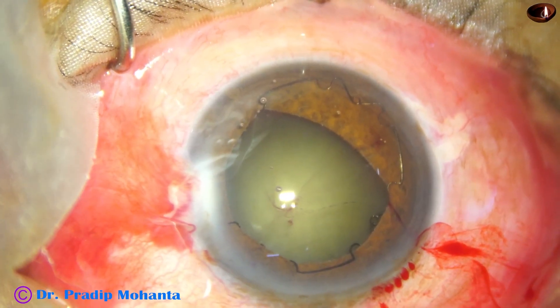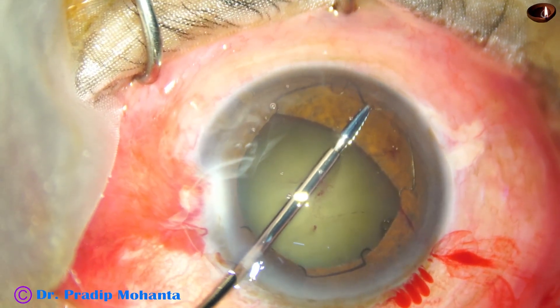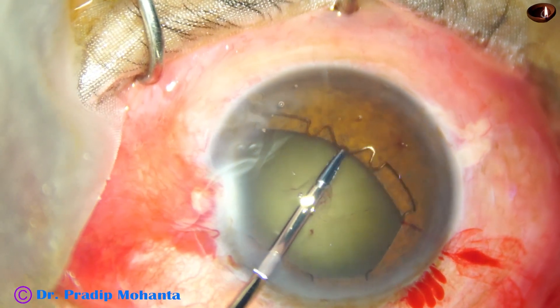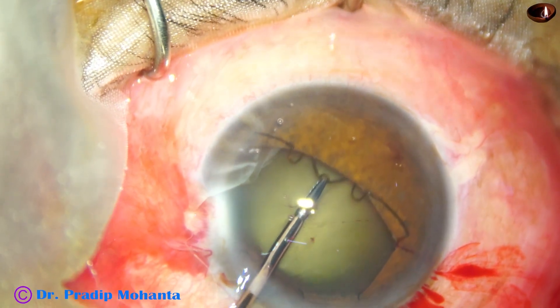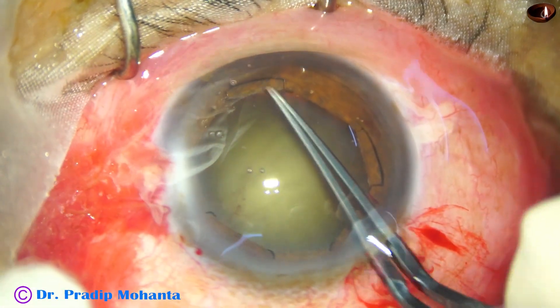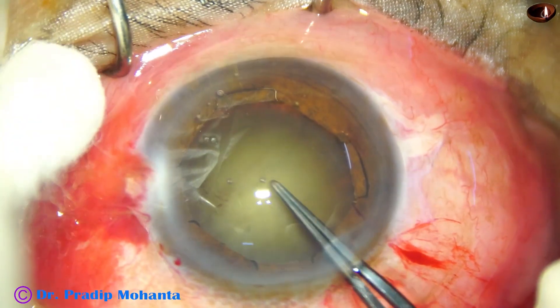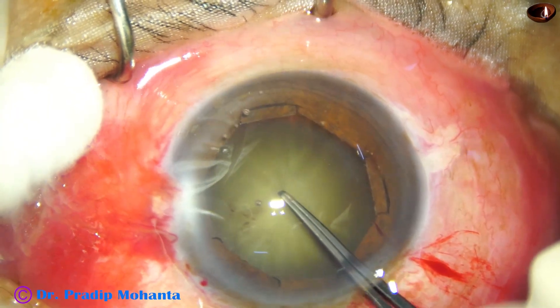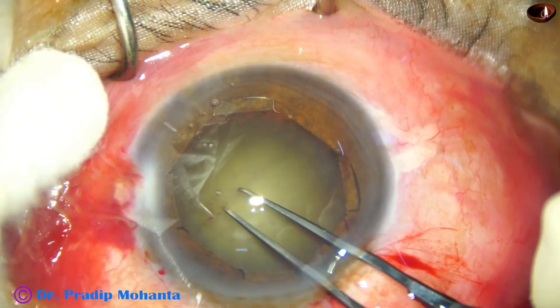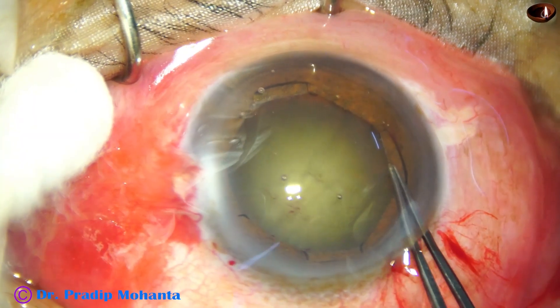In such cases, we cannot use B-Hex because the pupil is already dilated to more than 6 mm. These are cases when we need extremely good visualization — very weak zonules where the zonules may get torn at any time, and there can be zonular adhesions. You can see the whole bag is trying to come out as I try to do capsulorhexis.